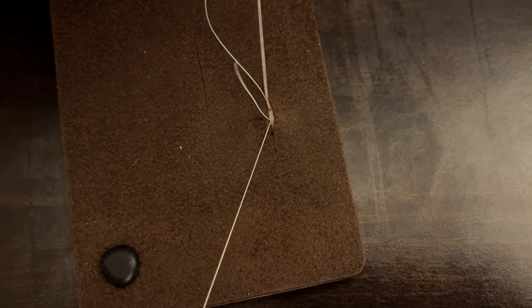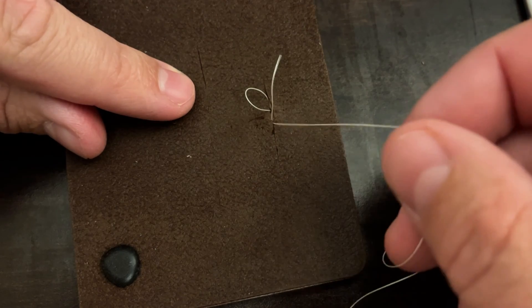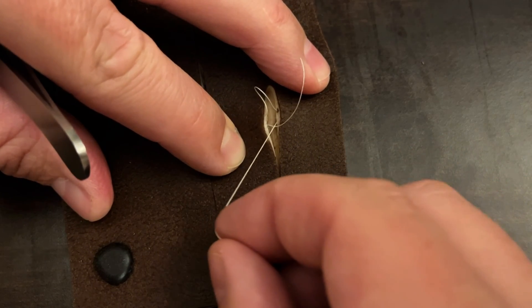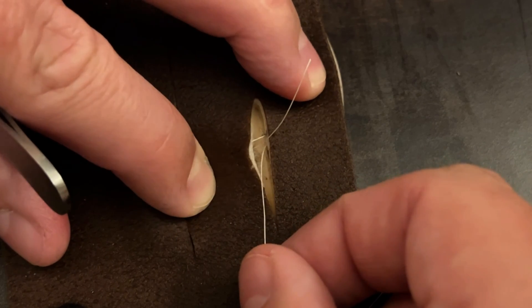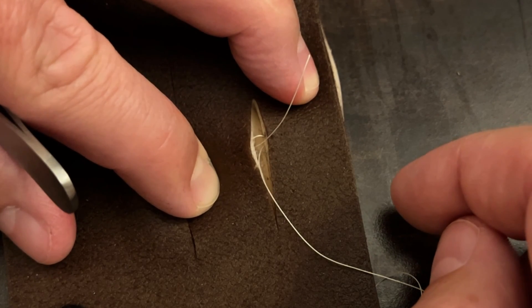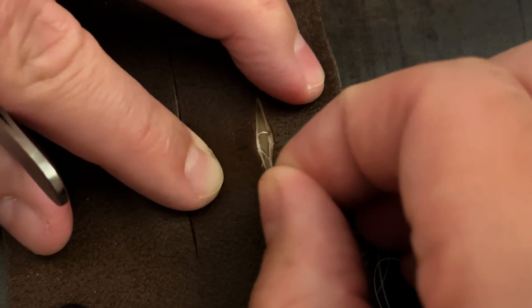Another important part: you want your tails to be on the same side of the loop. Notice I have my tail that I'm going to use to tie and the other tail still attached to my needle. As I pull this through you can see my loop and my tails are on the same side. If your tails are not on the same side and you tie this, the knot will be superficial and will also cause there to be a gap between the layers of the dermis. Make sure both tails are on the same side of that loop.